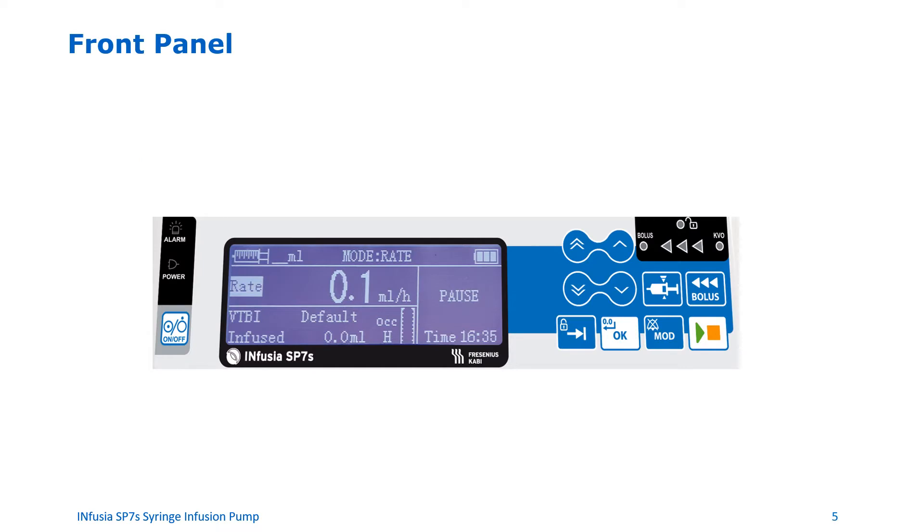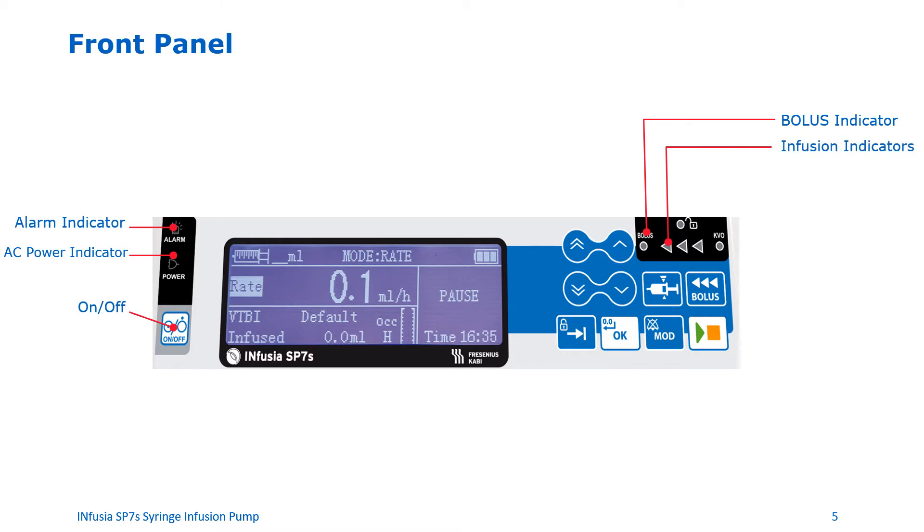Front panel of the device. Let's familiarize ourselves with the front panel. On the top left, there is an alarm indicator, which lights up when the pump is alarming. The AC power indicator lights up when the pump is connected to AC power. On the left-hand bottom, there is an on-off switch that allows you to turn the pump on and off. On the top right, the bolus indicator shows when the pump is in bolus mode. The infusion indicator lights up when the infusion is running.